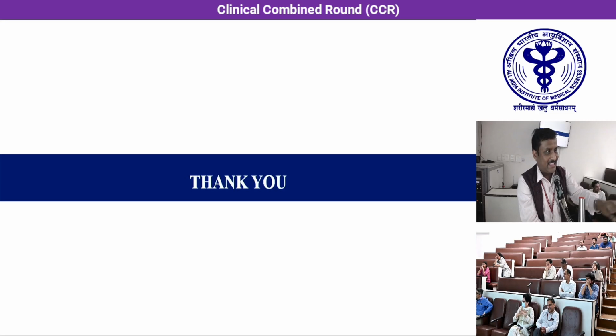So somehow, thanks for the confidence in us. But the message is that with robot, there are many complex surgeries which we usually do with an open approach, like RPLNDs and IVC thrombus. IVC thrombus, we have done only one, but RPLND we have done quite a few patients with the robotic approach. With robotic assistance, these complex surgeries can be done only if you have significant experience. But the message again is these should not be the standard of care.